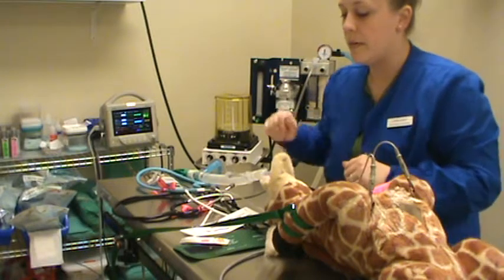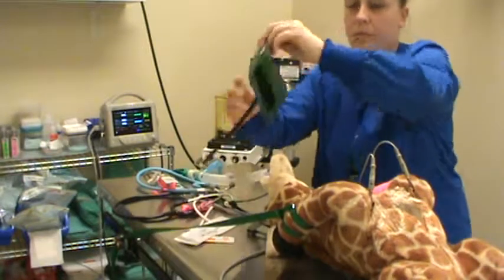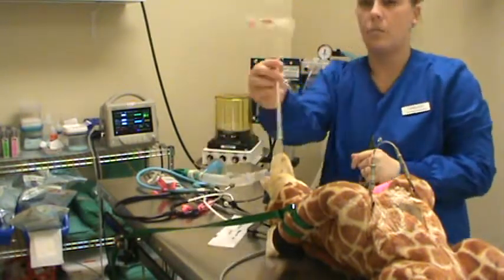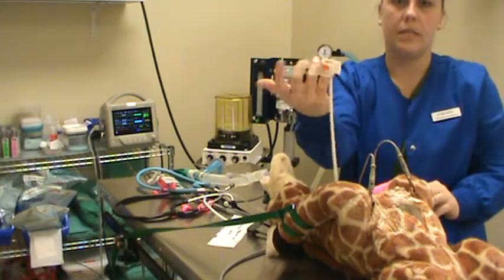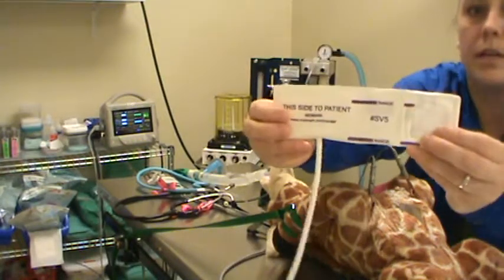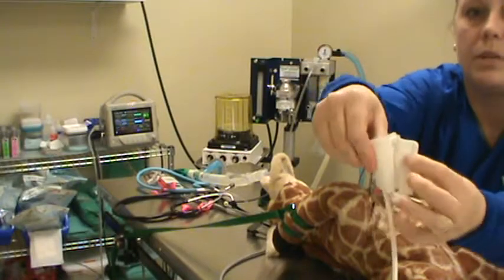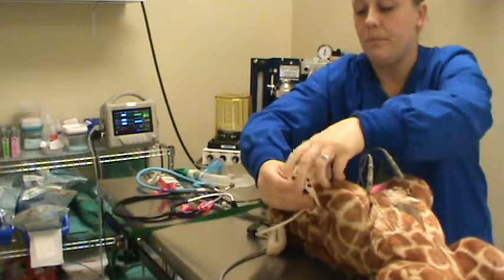Next thing we're going to put on here is our blood pressure cuff. We have a lot of different sizes of blood pressure cuff, all the way from the largest dog here, which is a size 8, more like your pit bulls, your shepherds, your larger breeds, down to size 1, which is your tiny little kittens that barely fits on your pinky, so they have tiny little feet. This patient is going to take a size 5. The patient's limb needs to fit in this range right here. When you circle out around the limb, it needs to be within that range. So we're going to choose a size 5 for this patient and hook that up.